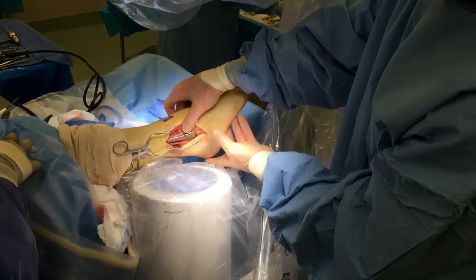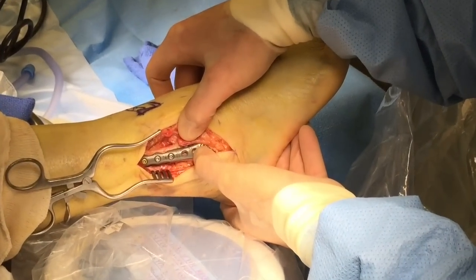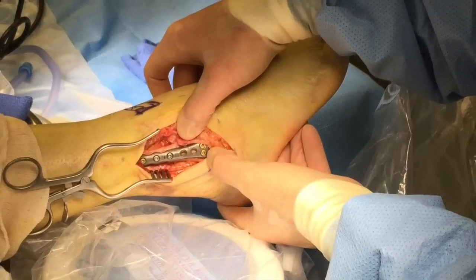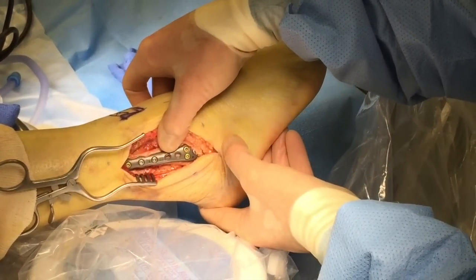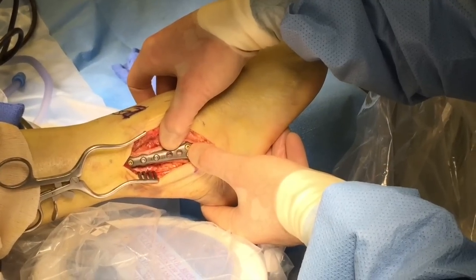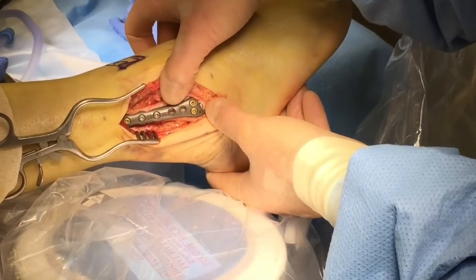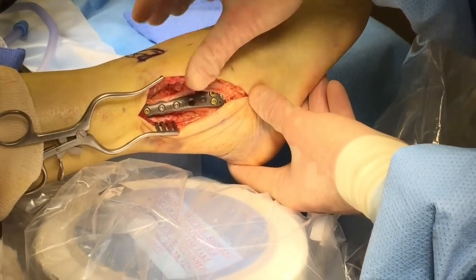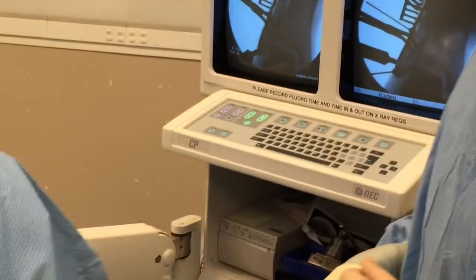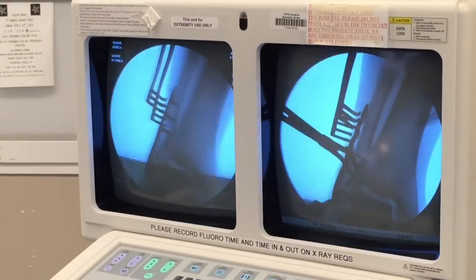Now we're finished — the finished product. The fracture is along this line right here. Maybe we could have put another screw in here, but these three locking screws — one locking distally and these two screws — are so tight that we have good distal fixation, so we left those holes open. Three screws above is fine for an oblique fracture. We'll get an x-ray now — take a look over here and you'll see they're all lined up on the fibula right there.